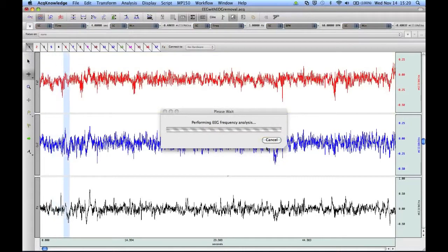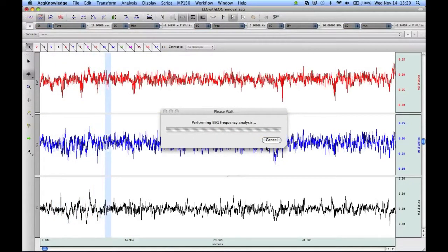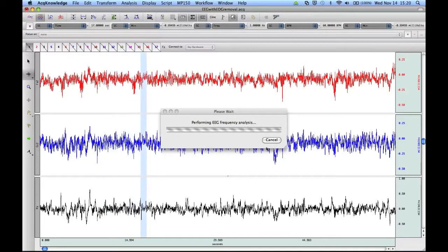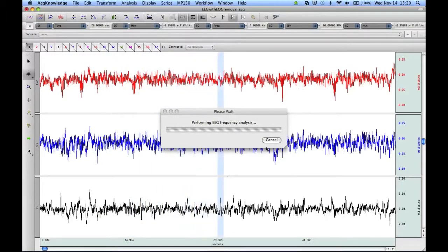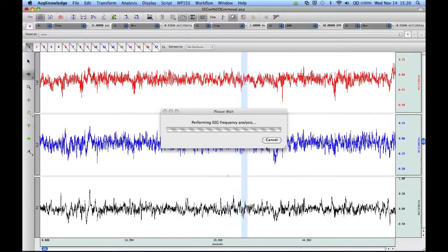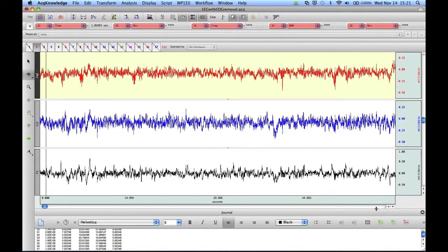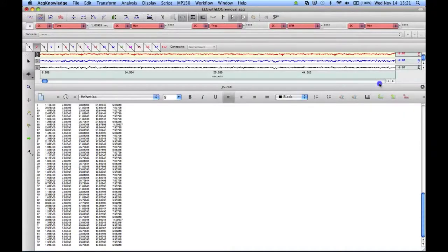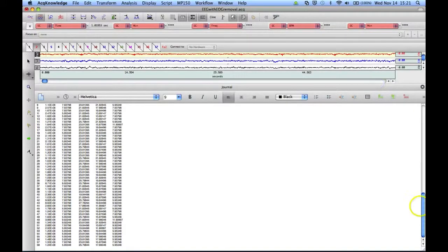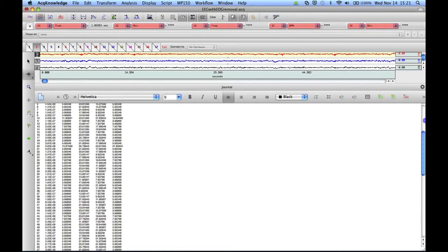After we click on OK, the analysis routine will go through each of our one-second windows and perform the EEG Frequency Analysis. Once the analysis routine is completed, you'll see that we have the analysis results down here in the built-in journal.